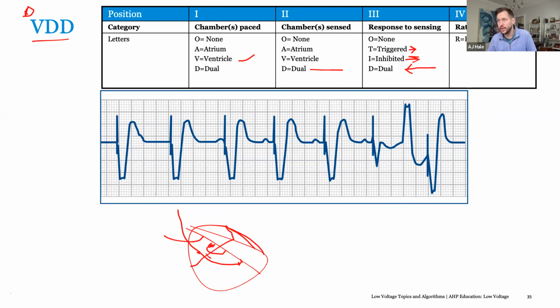An advantage of one of those leads, and I don't use those, Abbott doesn't make those, but there are companies who do make them, is you don't have to worry about occlusion as much because you're only putting in one lead. It's more simple because you only have to stick once. We'll go through the implant procedure some other date, but it's simpler to put in. So you will see these occasionally, but probably not super common. I only know one physician who really uses them up here in Boston. Didn't really know anyone in St. Louis who used them at all, but this is something you may see.